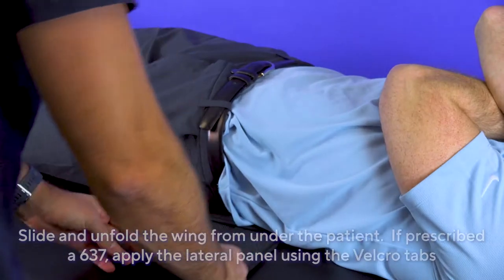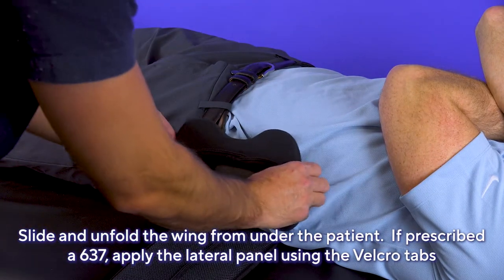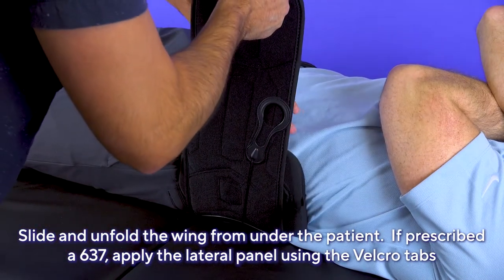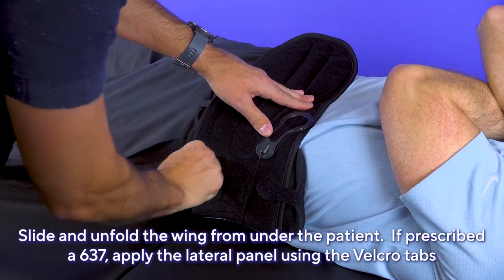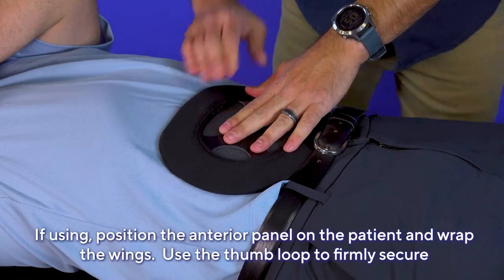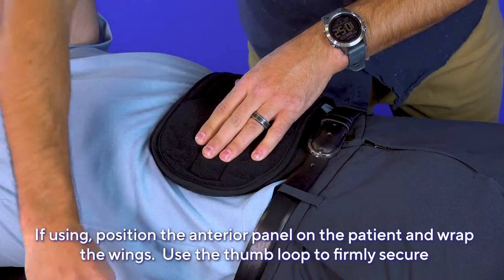At this point, if a 637 model has been prescribed, apply the lateral panels using the Velcro tabs to secure them in place. Position the anterior panel if using, and wrap the wings around the patient. The wing with the thumb loop will be on top — use that loop to firmly secure the wings.